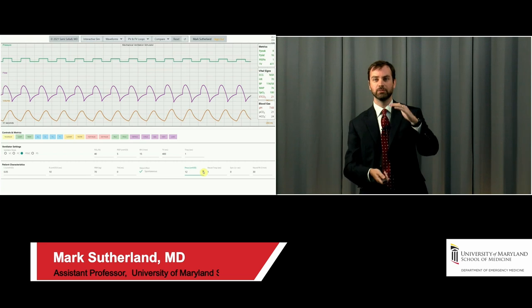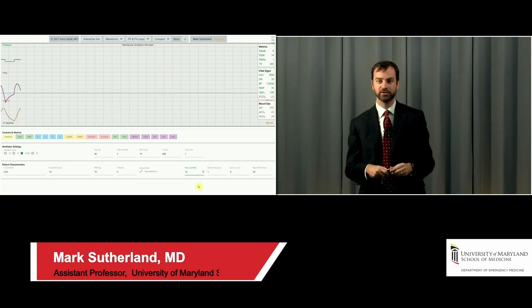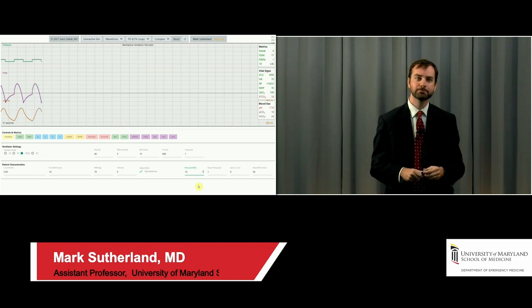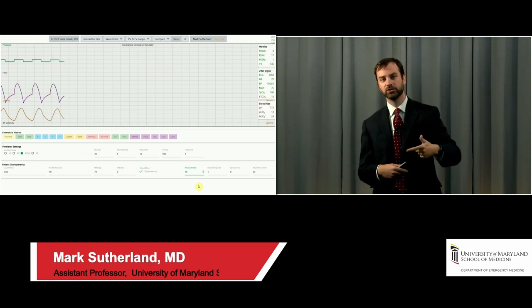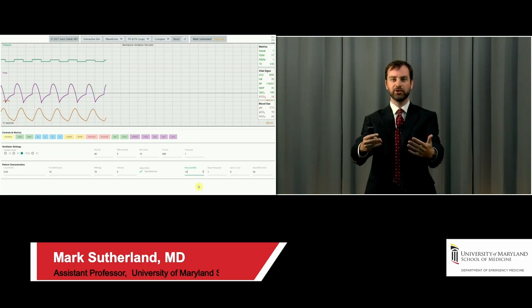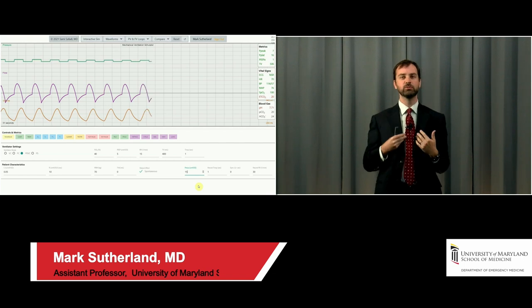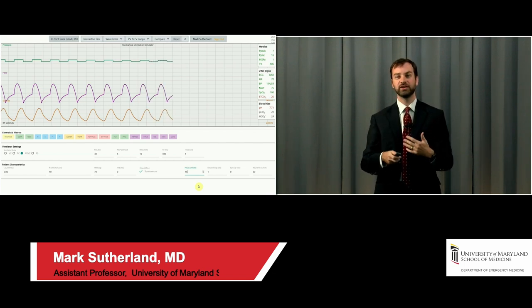The machine is giving them less and less support as they draw more and more air themselves. And I'm increasing the PMUS, if you're watching the video there. And this is just worsening the cycle. So the way I describe it is the patient is chasing after the ventilator and the ventilator is running away from the patient. Every time the patient says to the ventilator, give me more support, the ventilator says, I'll give you less support.